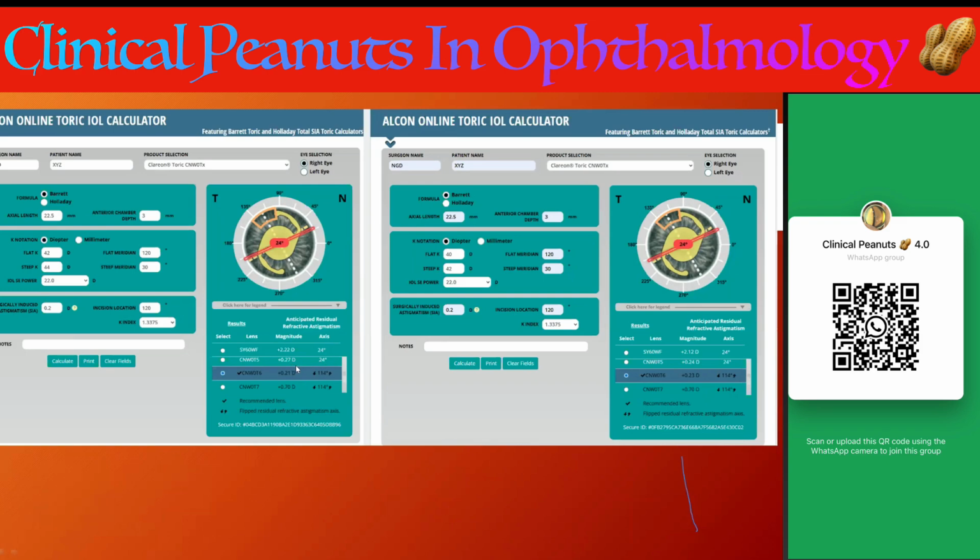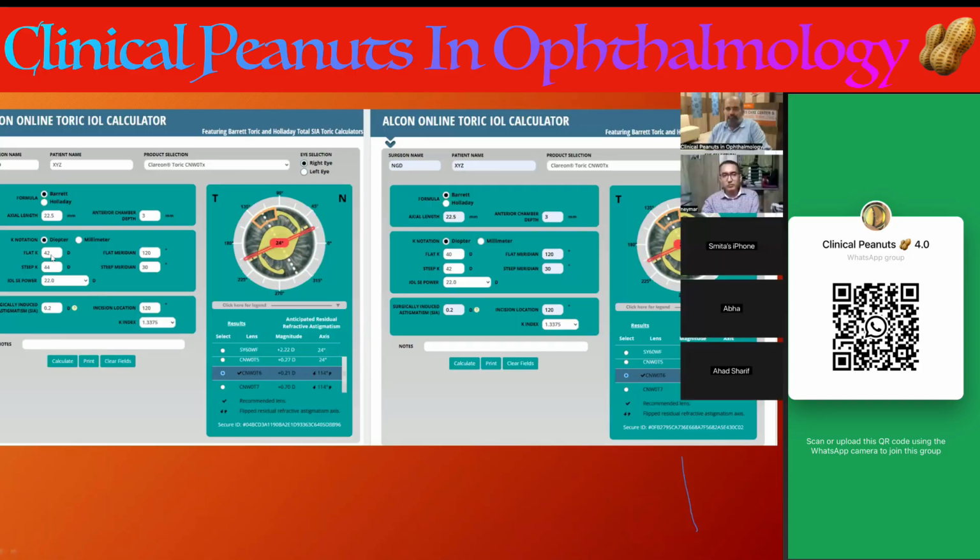but it is not always mathematically possible to negate all the astigmatism. Some of the power will remain, and you need to choose the model on the basis of your perspective: in which axis you want to leave the residual, or what residual you want to keep over the cornea. Here in these two diagrams, you can see that the astigmatism is the same.